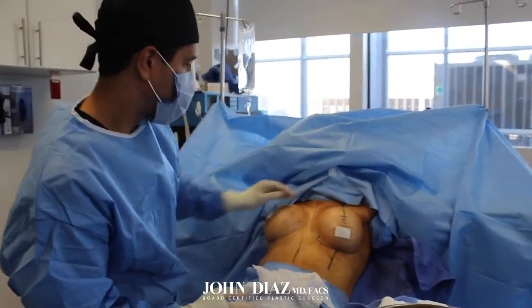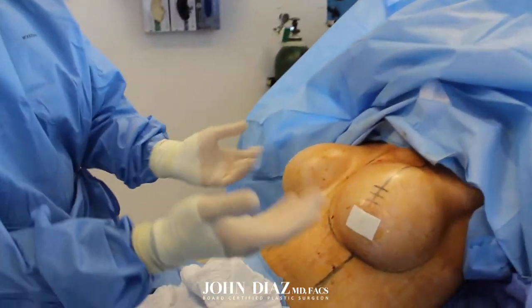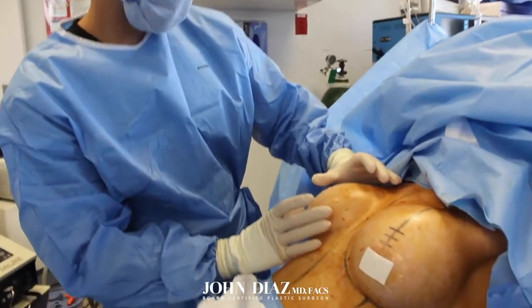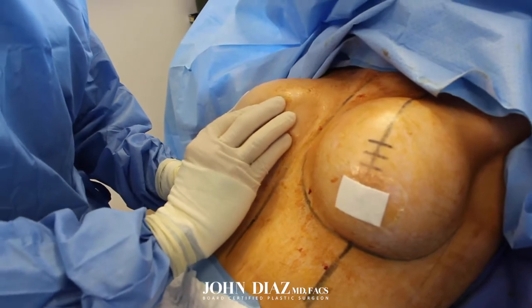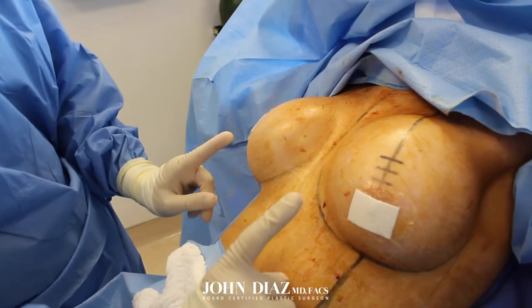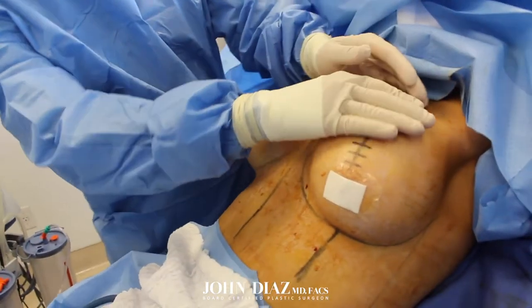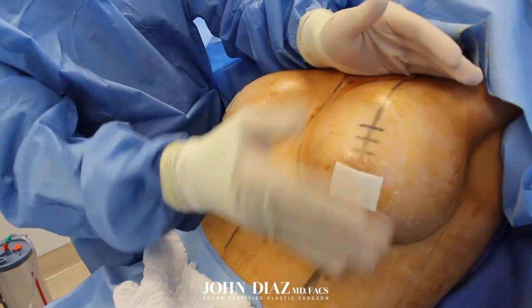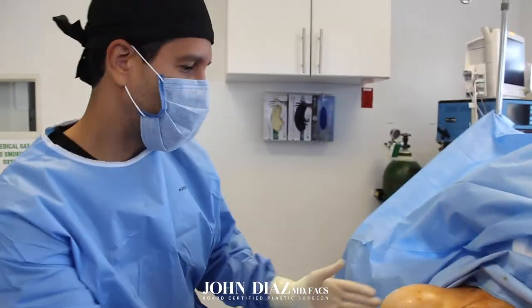If you see here, she has pretty severe asymmetry. The nipple positions are completely off. The breasts have also developed capsular contracture, which is when scar tissue around the implant gets hard, squeezes the implant, and then pushes it abnormally high. Most of the implant is up here and very little down here, so it's very mismatched and imbalanced.